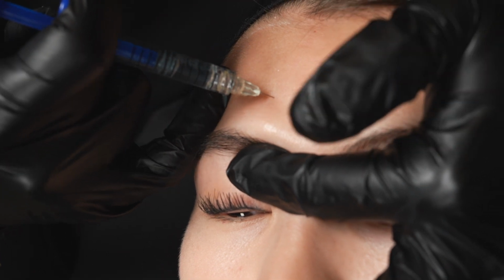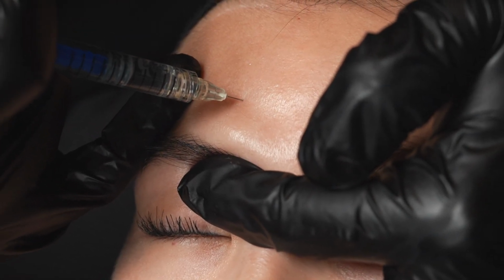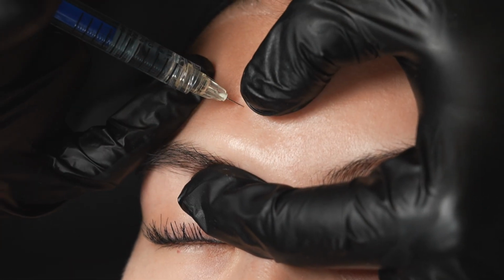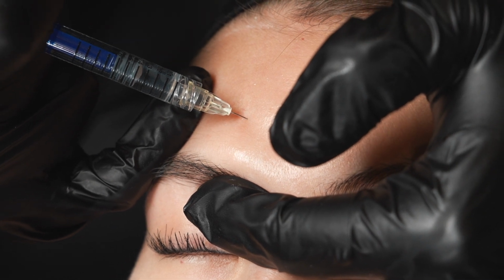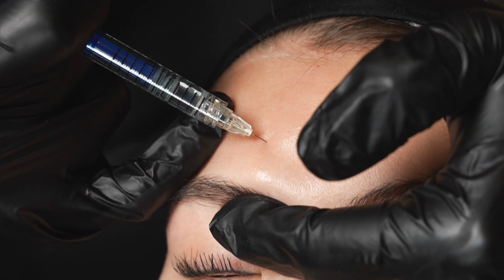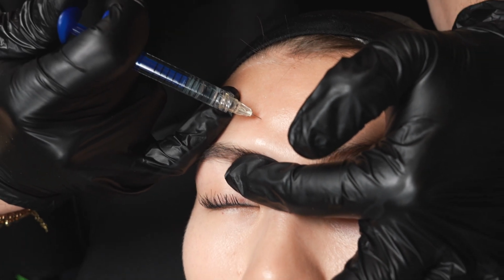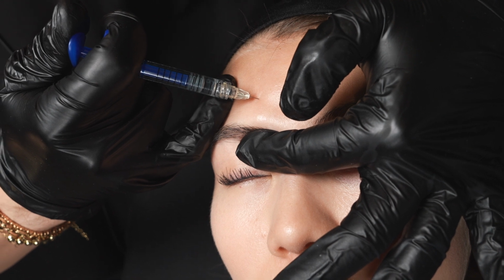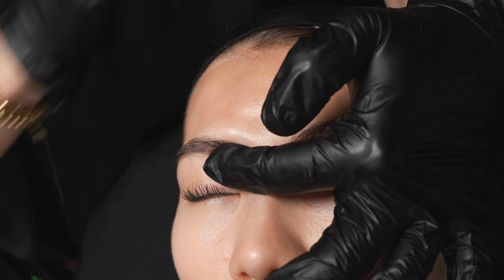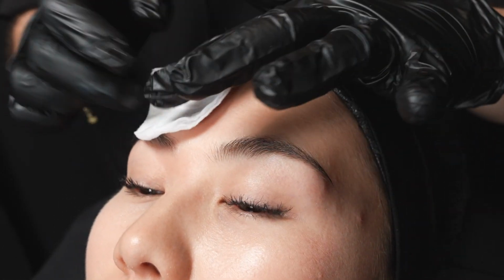Почему? Потому что я могу блокировать своей недоминирующей рукой эти артерии, которые исходят из орбитального рима. И вы видите, я стабильно фиксирую, опять-таки под гале работаю и аккуратно, медленно ввожу препарат для того, чтобы заполнить. И я блокирую внутреннюю артериальную систему. Даже если вдруг я пенетрирую артерию, то продукт не зайдет непосредственно в артерию. И я еще блокирую поток, чтобы не было обратного потока из артерии. Вот сейчас маленькую коррекцию сделала, сейчас лучше выглядит наш лоб.